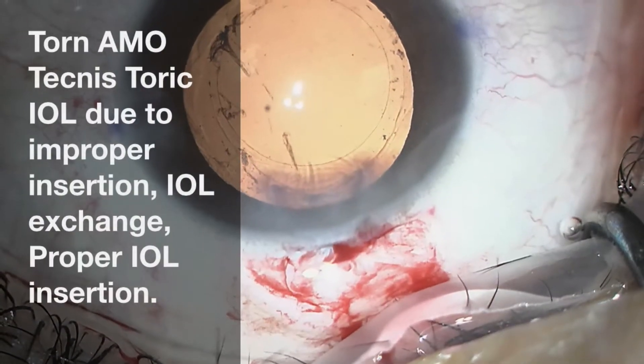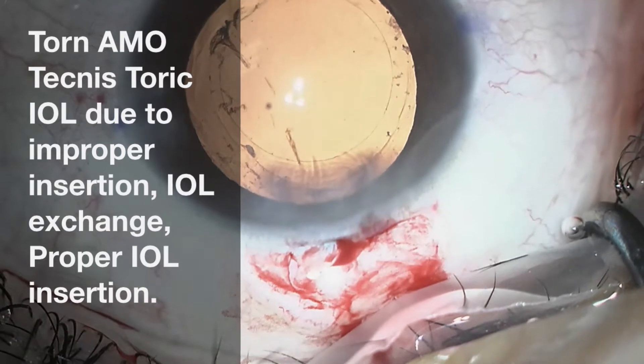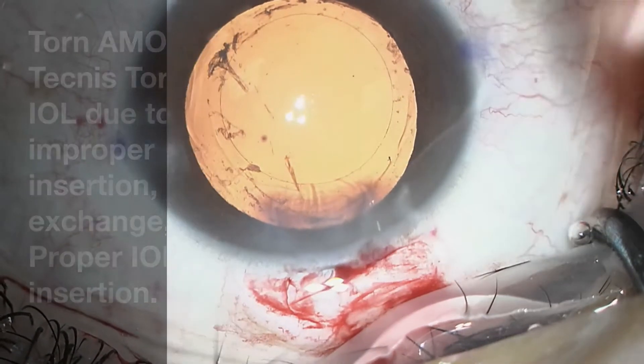Hi, this is Dr. Shannon Wong in Austin, Texas. I'm going to demonstrate improper and proper eye well insertion of a toric lens implant.